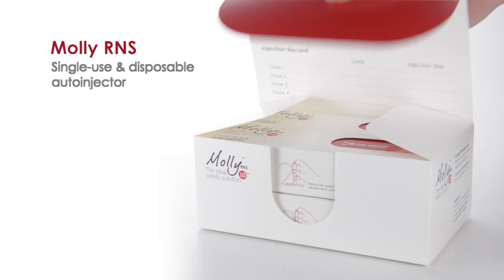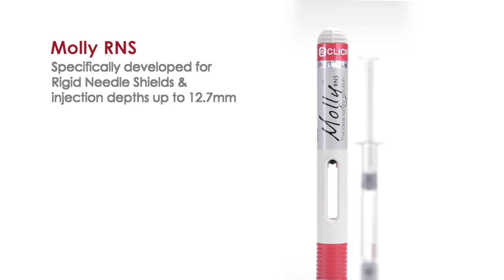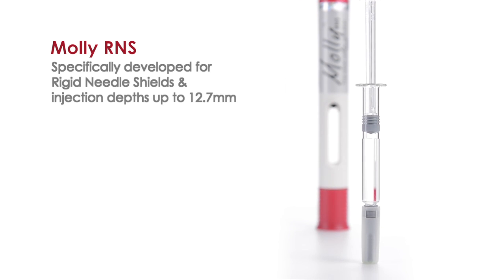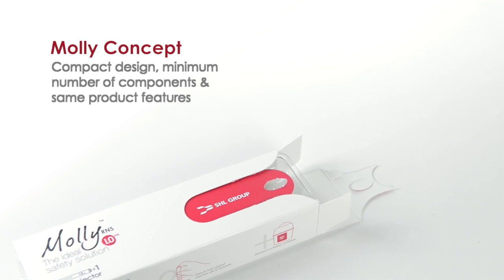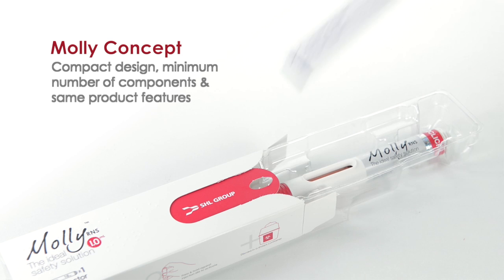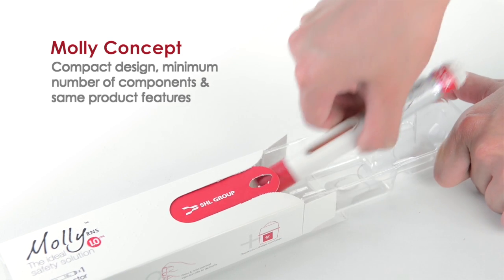MOLLE-RNS is a single-use disposable auto-injector. This version of MOLLE has been specifically developed to accept syringes with rigid needle shields and is available with pre-set injection depth up to 12.7 mm. MOLLE-RNS stays true to the original concept of MOLLE and maintains a compact design and a minimum number of components, as well as the same product features.